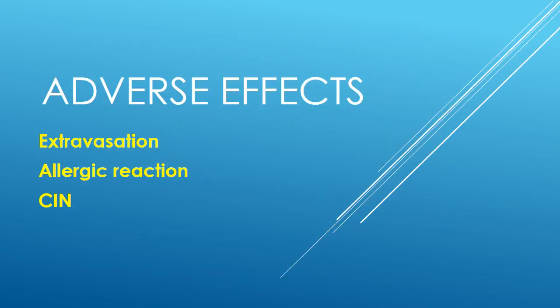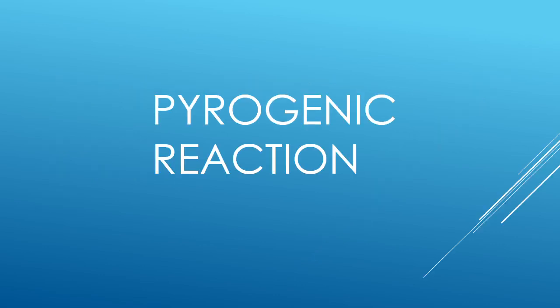But then what are the adverse effects? There are 3 of them which are very commonly seen: extravasation, the allergic reaction, and CIN, which is contrast induced nephropathy. But there is a far more important adverse event which we are never discussing. This is the pyrogenic reaction.